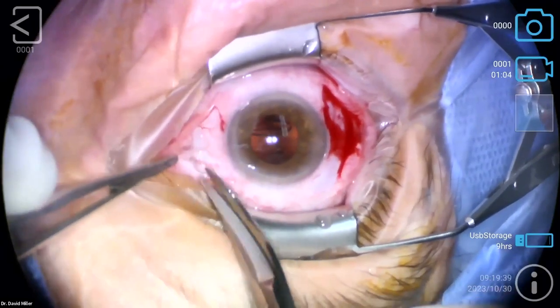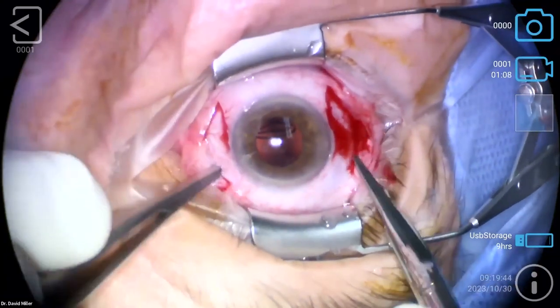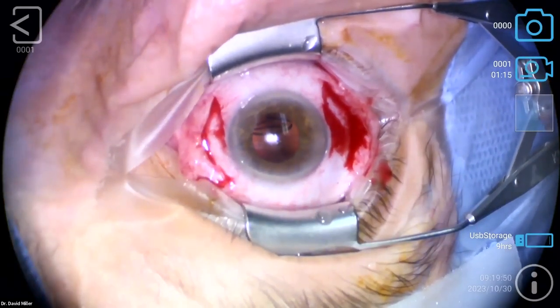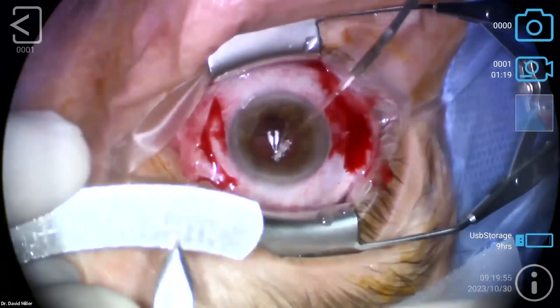And there we go. So I'm just cutting down the conjunctival tab. I'm making a nice peritomy, nasally and temporally. I don't worry too much about bleeding. And then just the calipers and a little BSS for the cornea. I'll take the calipers, I'll mark them, and I'll set them. So I go the 4 millimeters.